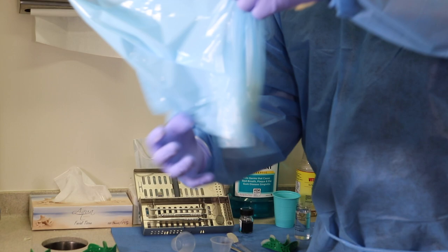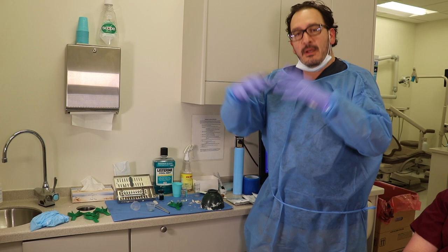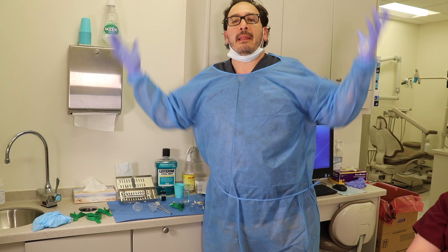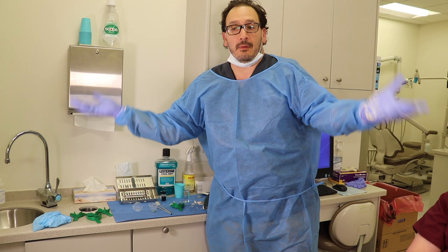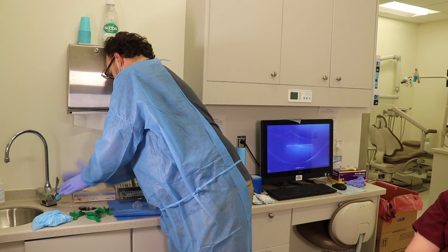I will leave this one in a sealed bag like this. Now my impression is in a safe spot, right? If you leave it outside without any water, it'll start expelling some water. If you leave it deep in water, it'll start absorbing water. As it absorbs or expels water, the alginate will start distorting, right? How do you say that, Marco? It'll start becoming distorted. Okay.